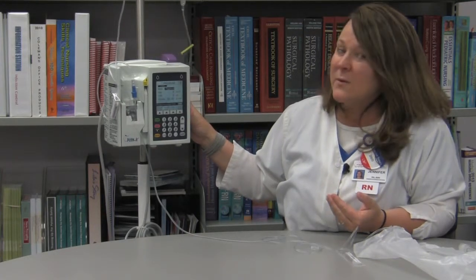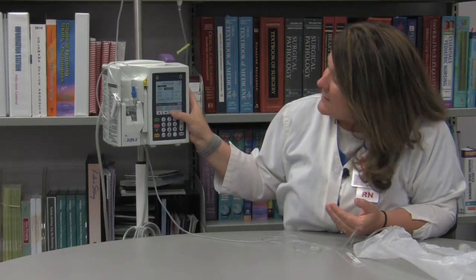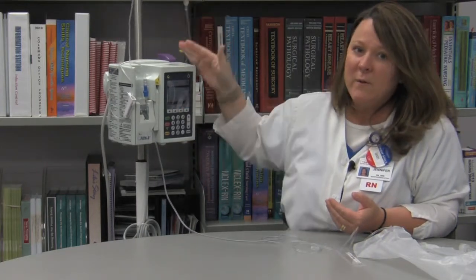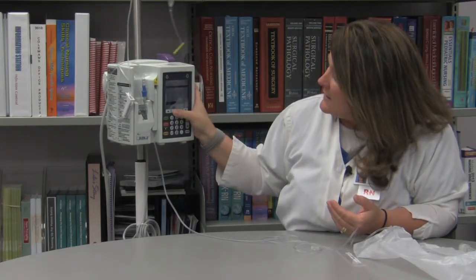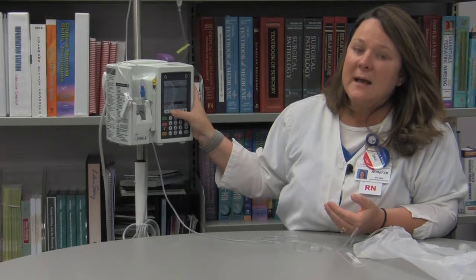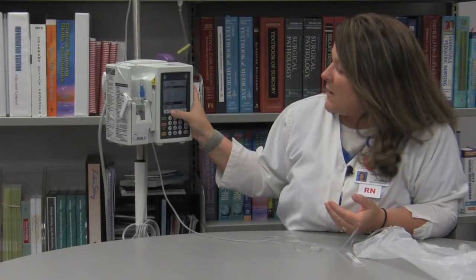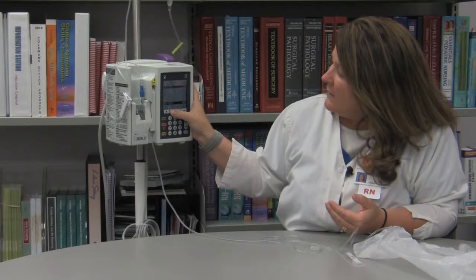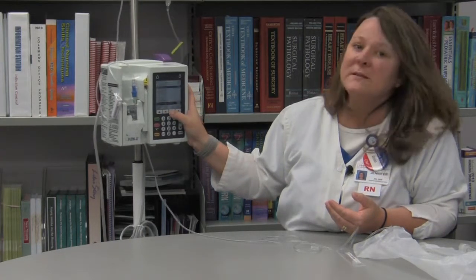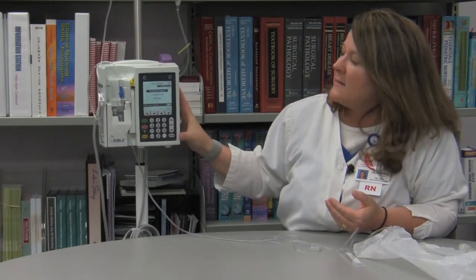The next most important thing we're going to do is go through the drug list. Correct. So through the drug list, and we're going to find our antibiotic or whatever we've got hanging here. Okay? So again, the antibiotics typically in most of the CCAs, the clinical care areas, are at the bottom of the list, so it's probably going to be best for you to page down, and you'll get through some of those quicker.